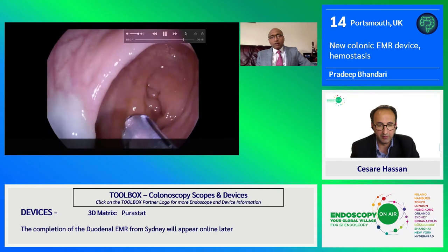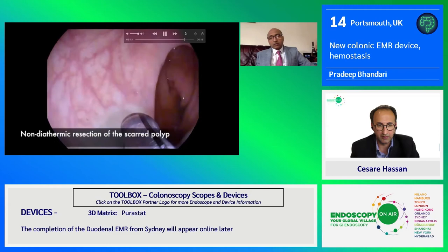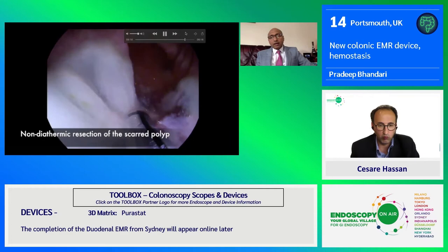It's rotating and cutting at the same time and sucking the tissue. We go generally from left to right because the clockwise rotation of the blade allows this cutting if you go from left to right in a very nice way.